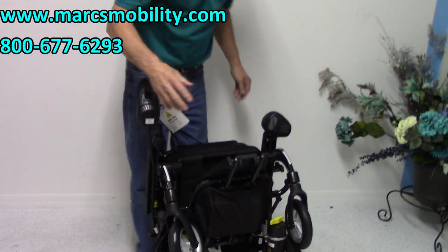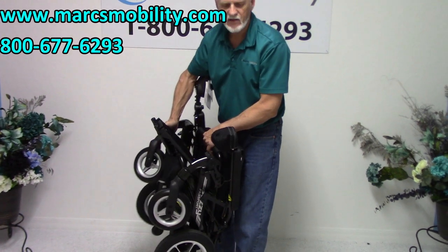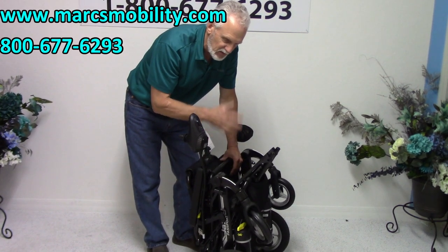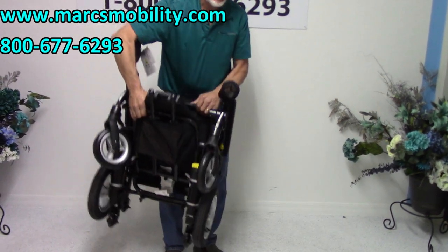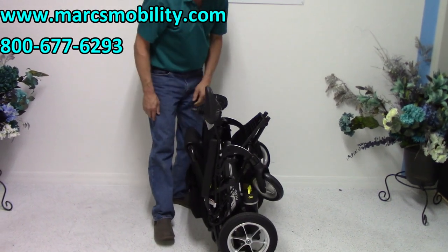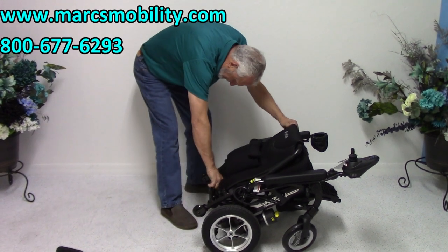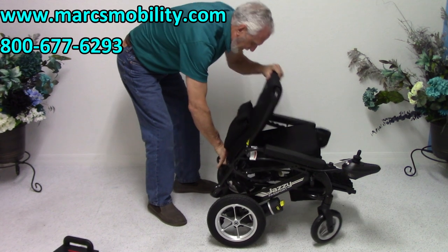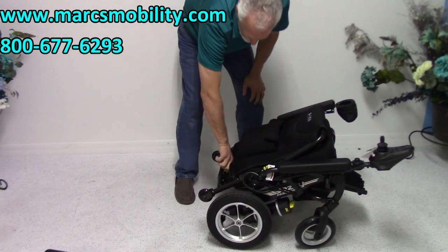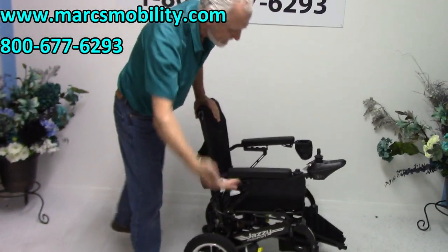In this folded state, it's 54 pounds — not the lightest to lift, but it's portable. To unfold it, bring it down and squeeze the levers to unlock, then push down a little bit so they release. Squeeze the levers, then bring it back up. So remember: push down, squeeze the levers, bring it back up.